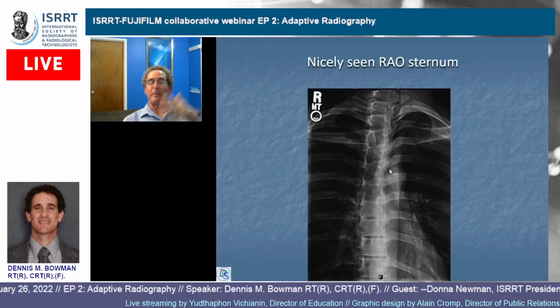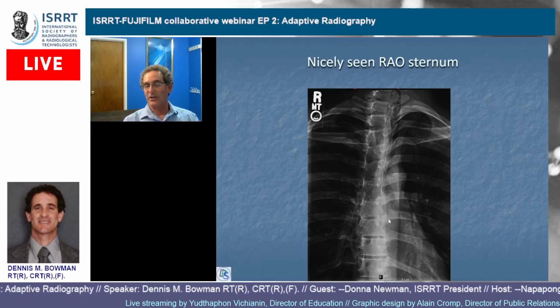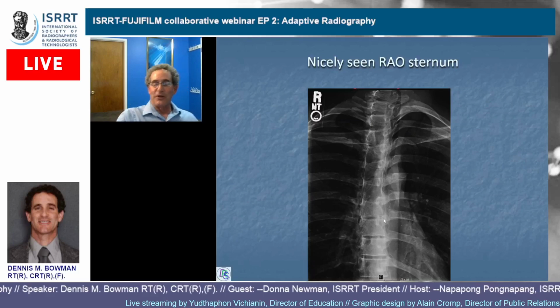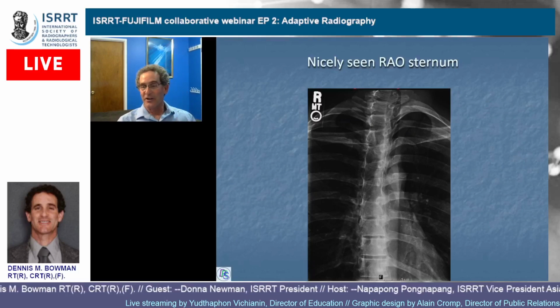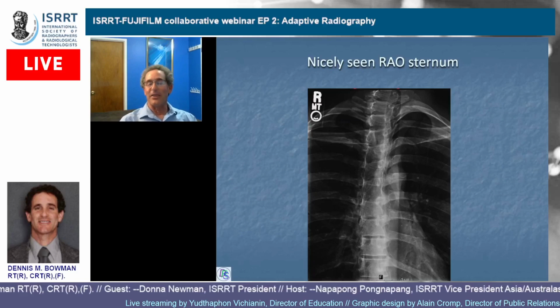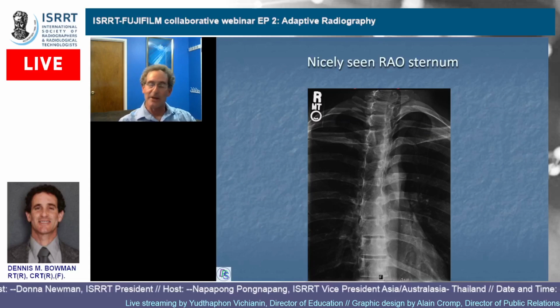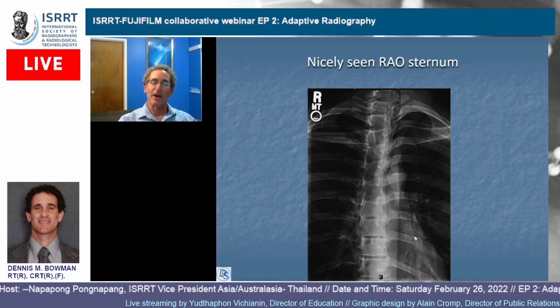And for those of you that remember my whole sternum master story, how often do they come out this nice? Not that often, because it really just depends. They got to just have a perfect density sternum and perfect density lungs and perfect density heart, and if they have all that, then yes, you get to have a really great looking sternum. And if they don't, which this patient sort of does, but it's not that great, it's all up to the patient. It's not really up to you, but at least you're getting it centered by doing it the way I just showed you with the AP.